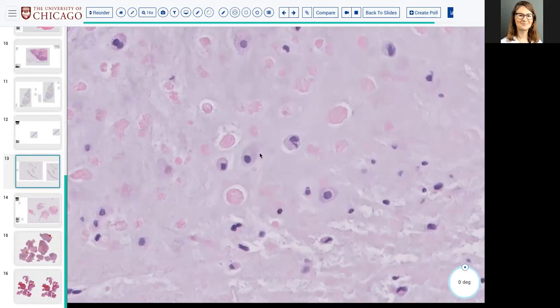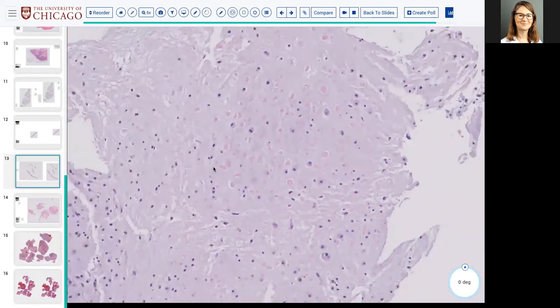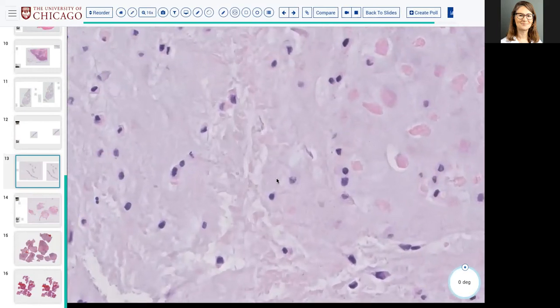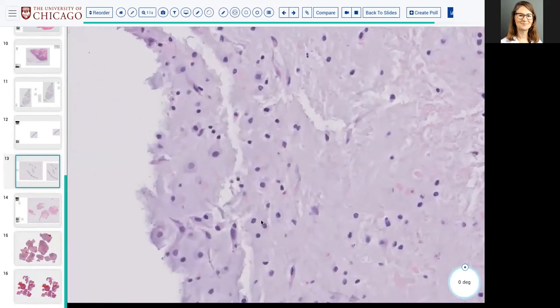nuclei, but of course there's also this kind of a rim of pale-ish cytoplasm, right? So pale-ish cytoplasm and nuclei present in individual lacunae, some with binucleation, no apparent architectural connection, attachment, grouping, clustering, not really, right? So that's indicative again of those lacunae and that glassy background and very small dark round nuclei again, exactly.